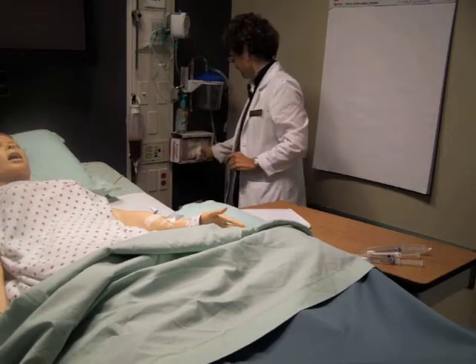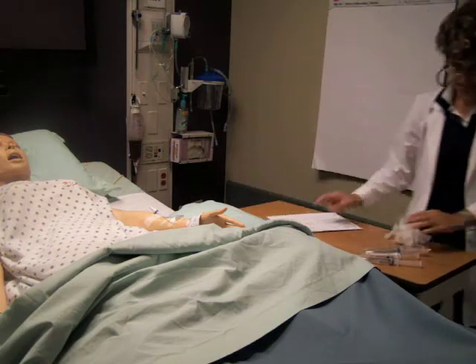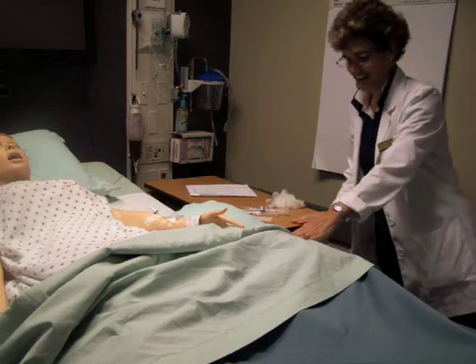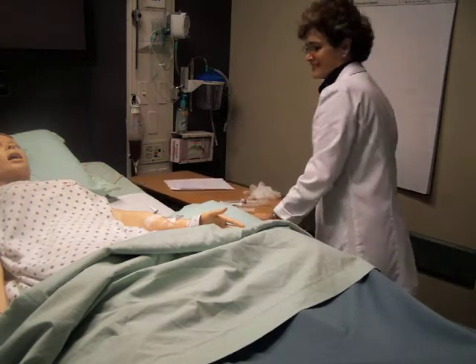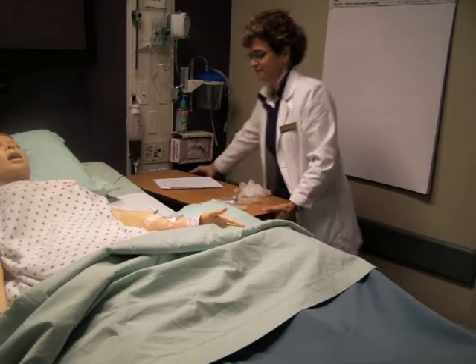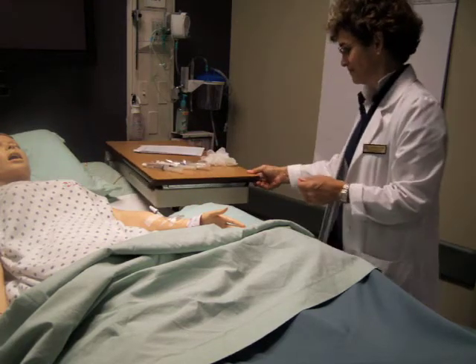Verify allergies by checking the client for an allergy bracelet. I explain the purpose of the medication to the client to reduce anxiety. Arrange your work area and position the client in the bed for comfort, privacy, and accessibility. Raise the bed as needed to protect the nurse's back.